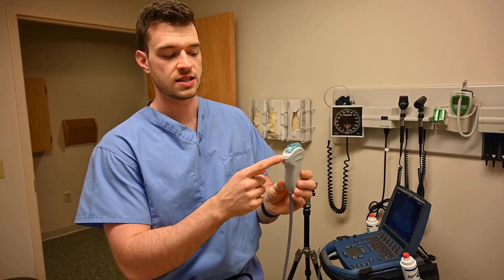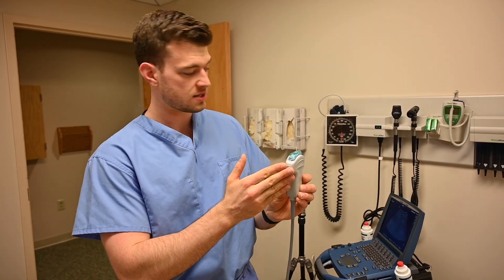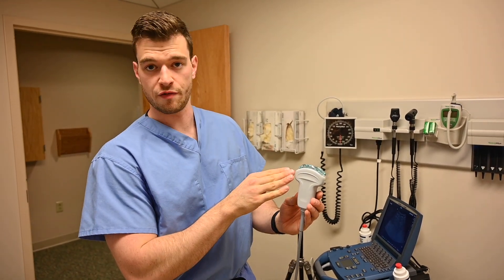One thing to point out is the indicator on the probe. This probe has more nubs on one side — that's the indicator side, which corresponds to an indicator light on your screen. In our case it's a small blue dot. You'll want to have that indicator usually towards the patient's right or towards their head.